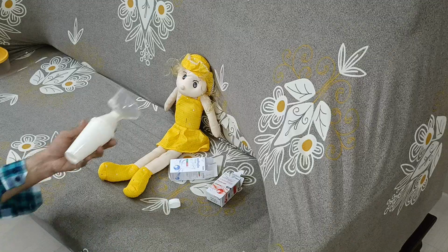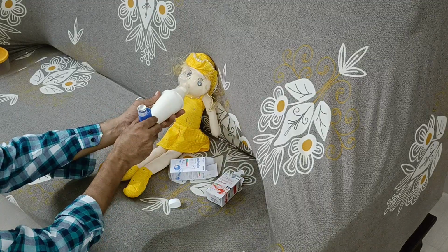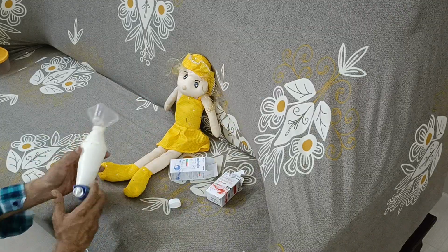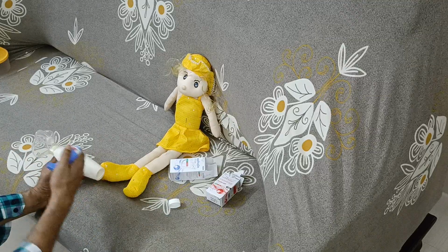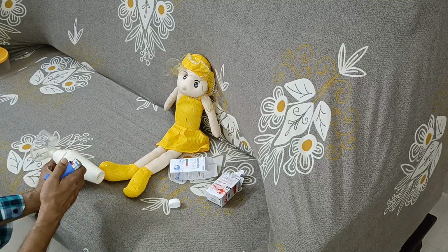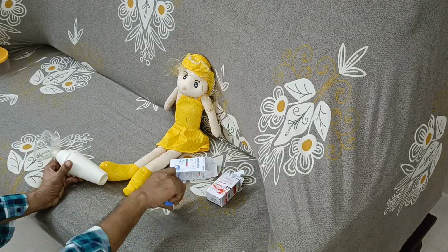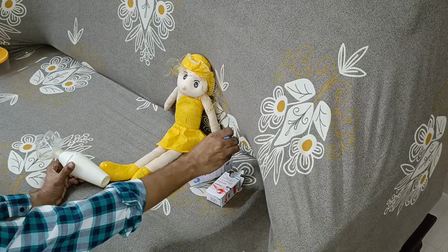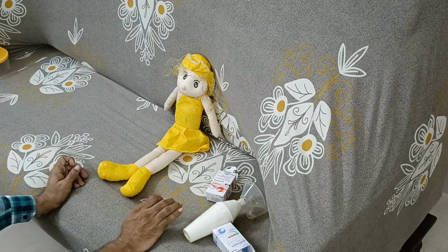Can I do it for a second time? Okay, take a slow breath this way. I'm going to attach it and press down, and repeat the same procedure. Once the patient has done it, the next job is to clean the spacer as well as the mouthpiece; just verbalize that. Also close this one, leave it over here, sign, and make the patient comfortable. So this is the way you are going to do pediatric inhalation in an OSCE scenario.